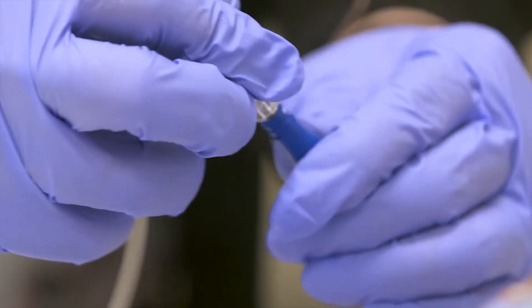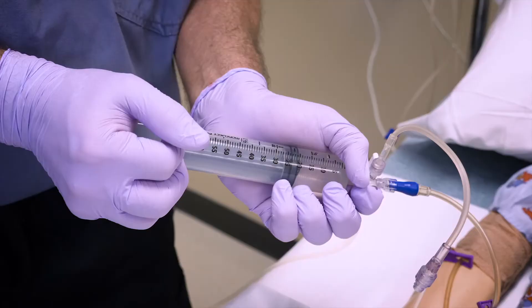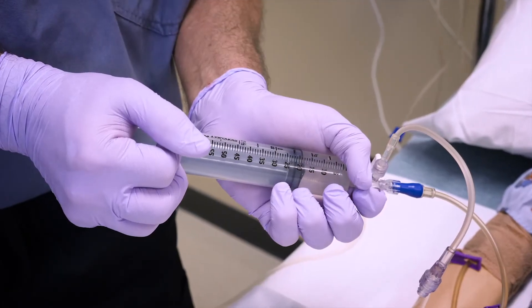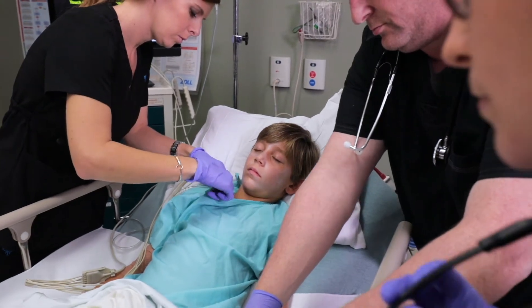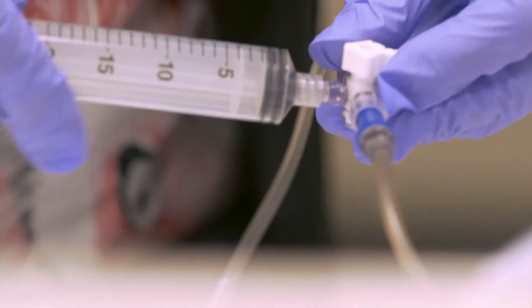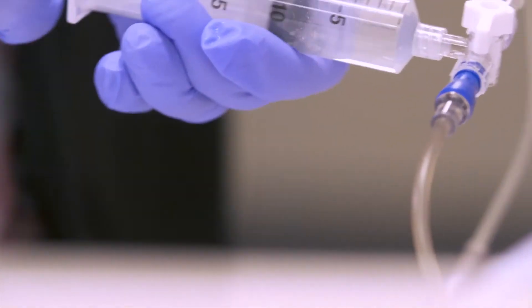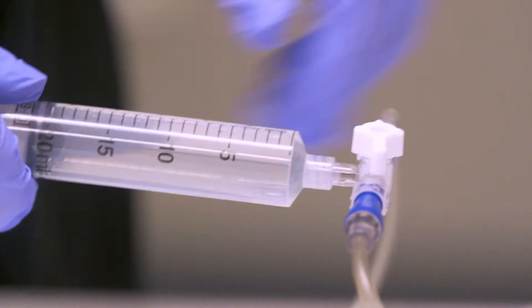One under-recognized avenue of catheter infection is the repeated use of a disposable syringe for fluid delivery. In pediatric emergency care, a method known as the push-pull technique is used to rapidly deliver fluids using a syringe and a three-way stopcock.